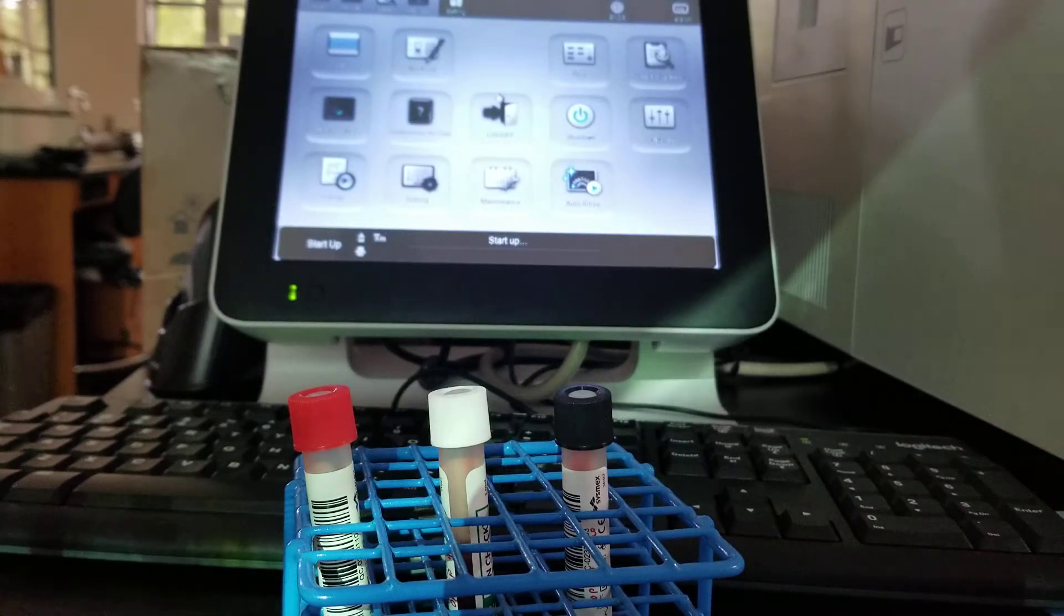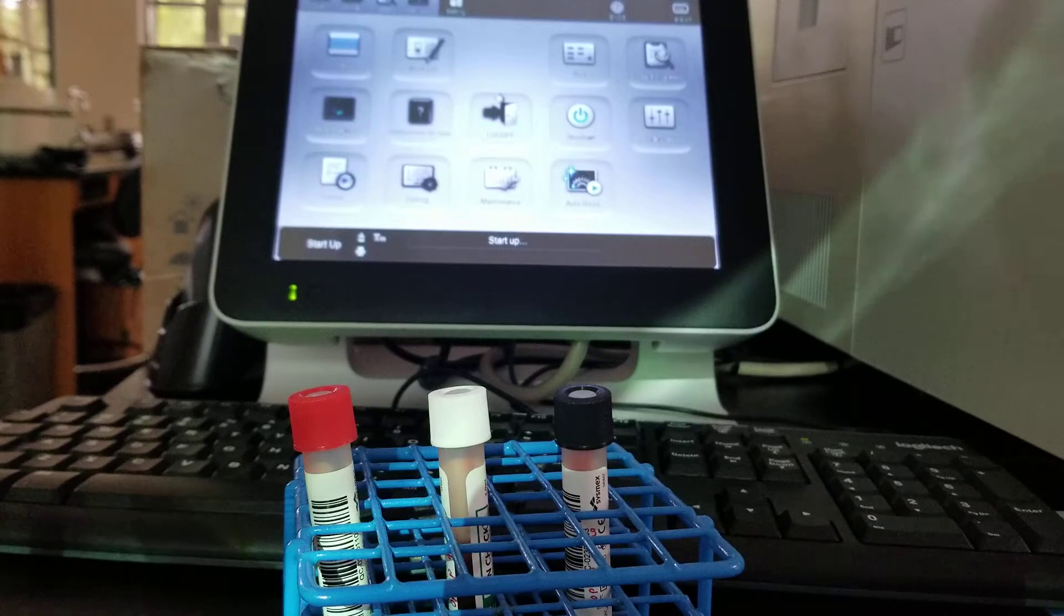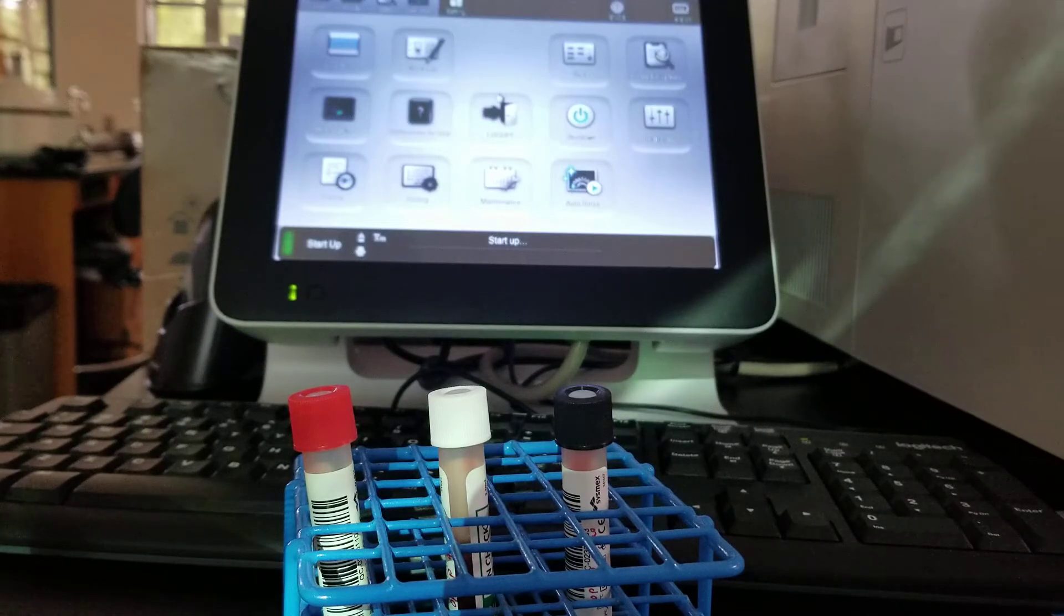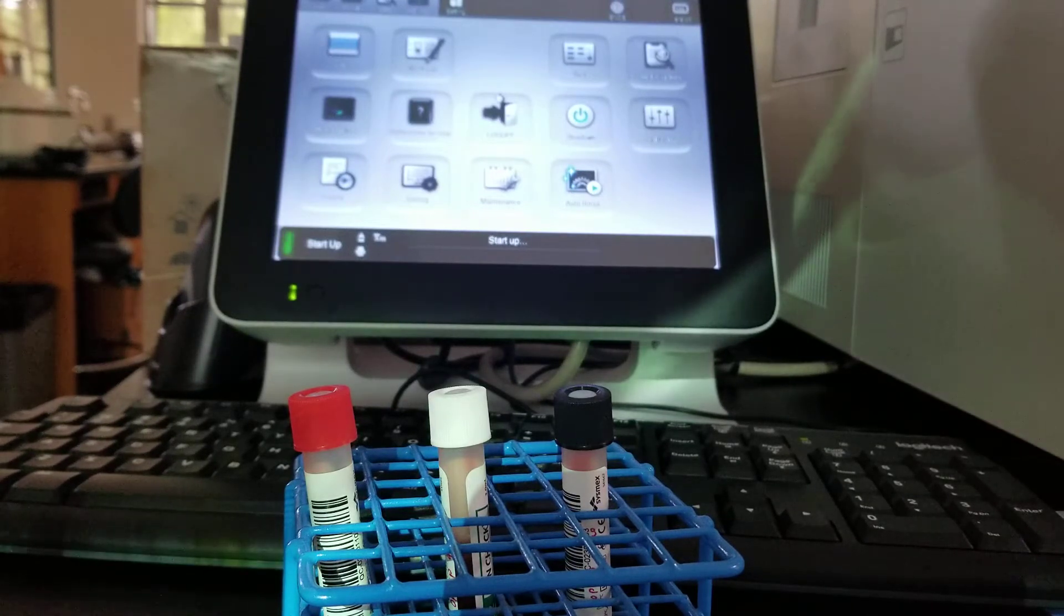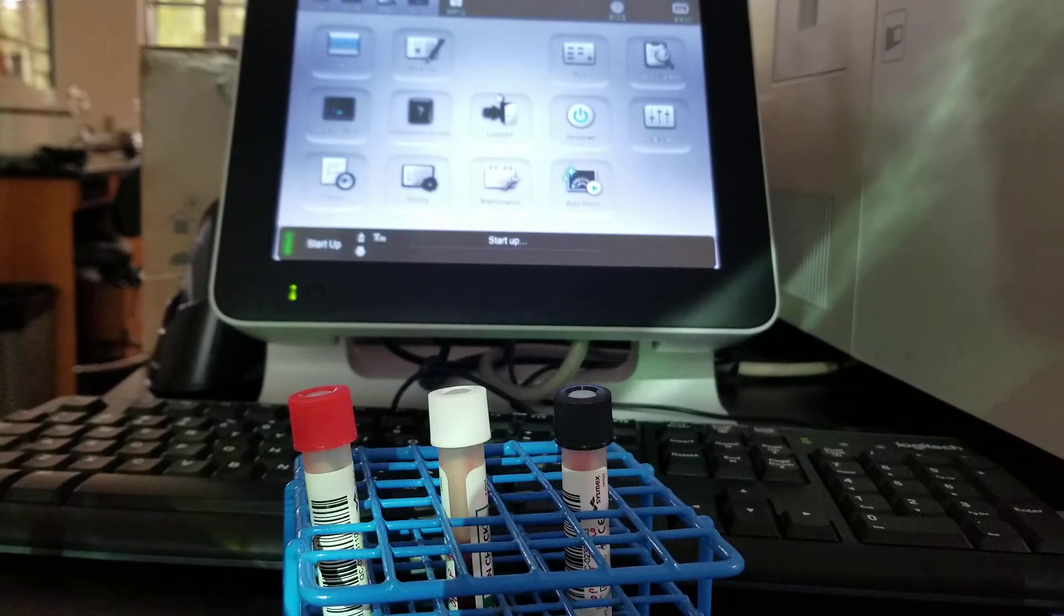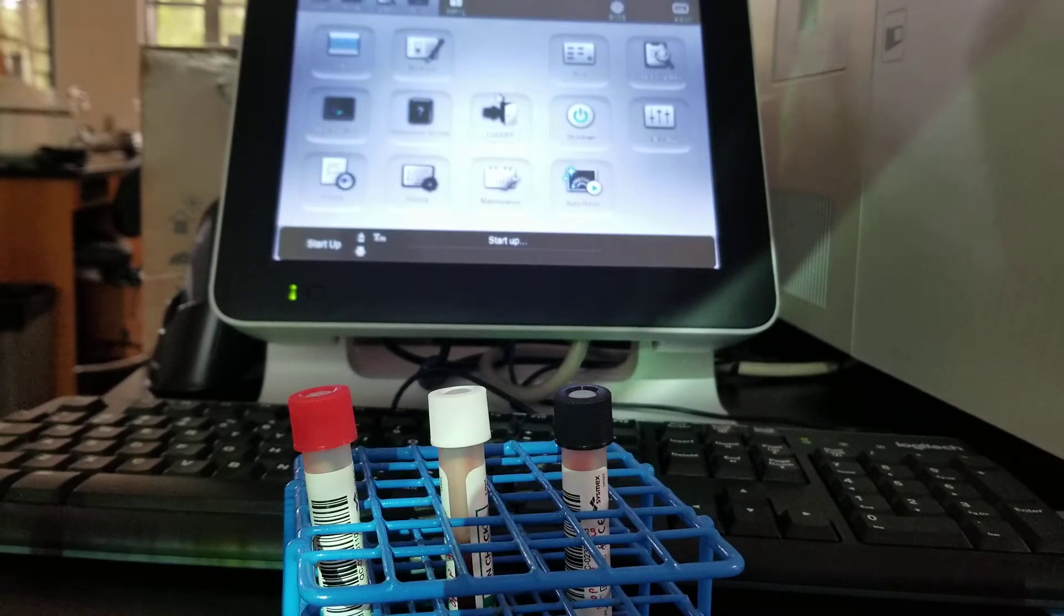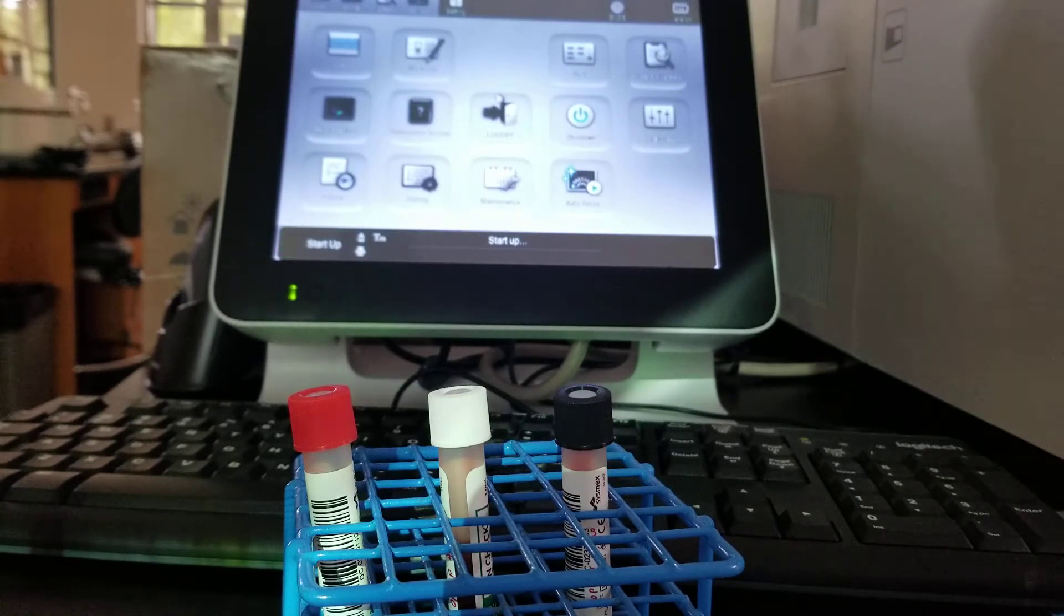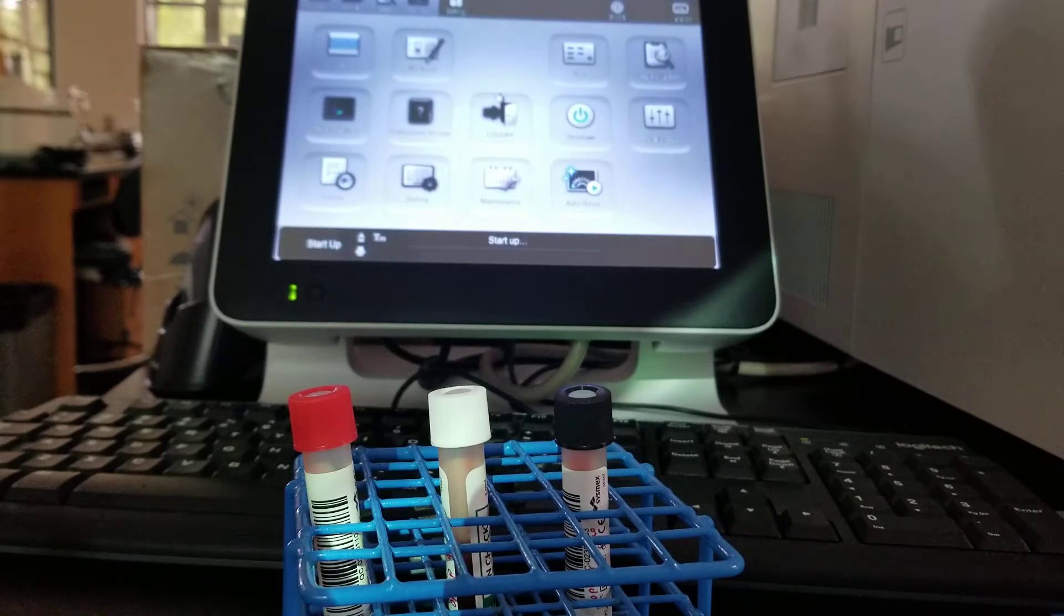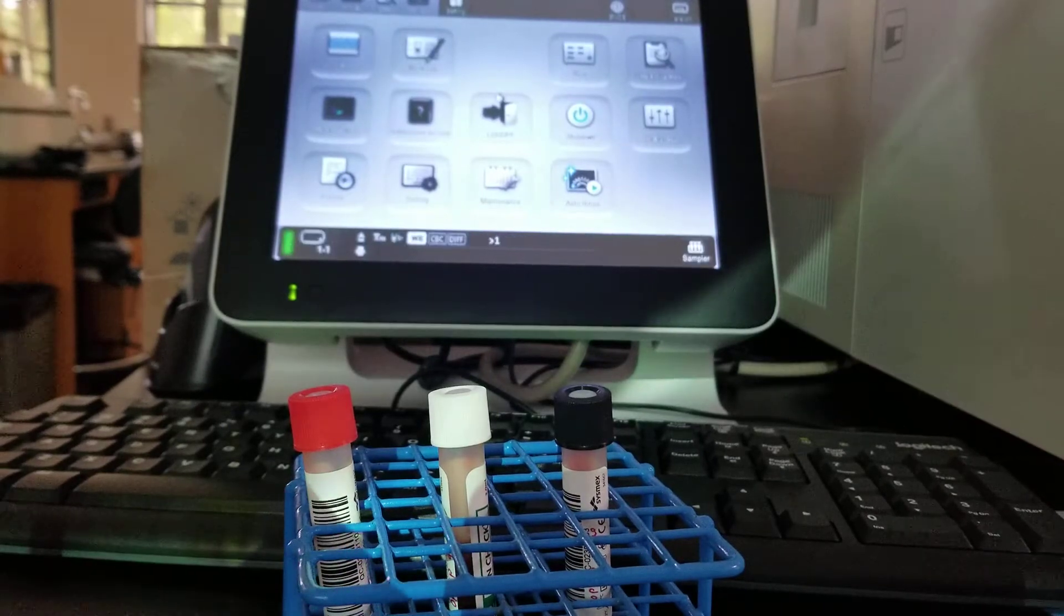You can pull one drawer out, load it up, put it in, and it'll start processing those. And then if you get more in, you can do the same with the other drawer. And like I said, you can interrupt it for manual mode as well.